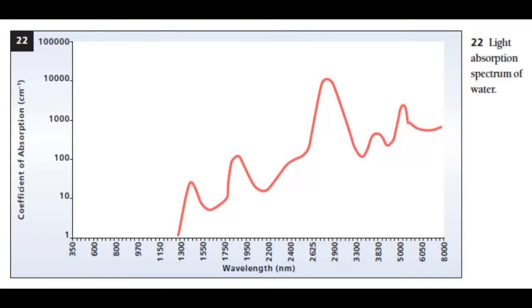Table 2. Mechanism of action. Although the exact details of the mechanism of action of mid-infrared lasers in the treatment of acne vulgaris have not been elucidated, ongoing research is being performed. All three wavelengths are well absorbed by water, resulting in bulk heating of the dermis as heat is propagated from the dermal water content. The laser beam emitted by each of the three systems is known to penetrate to the level of the sebaceous glands in the skin, typically located at 200 to 1,000 μm below the stratum corneum.